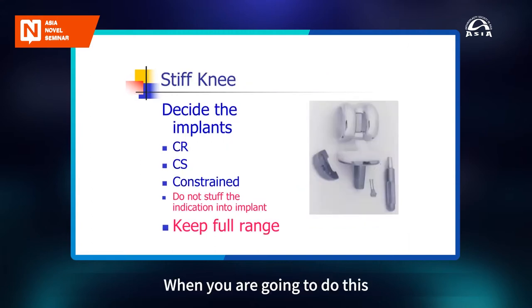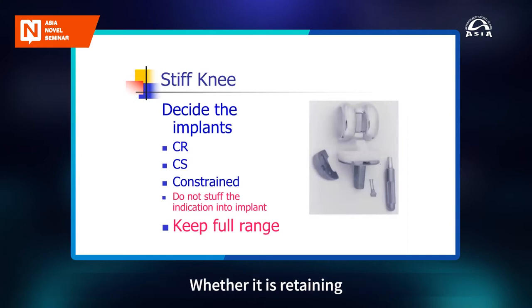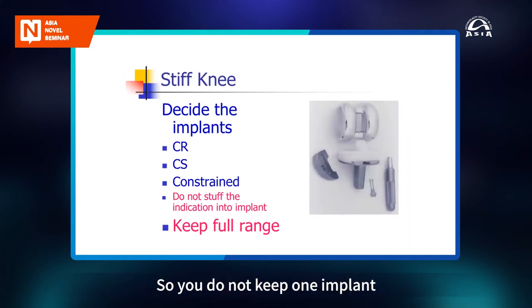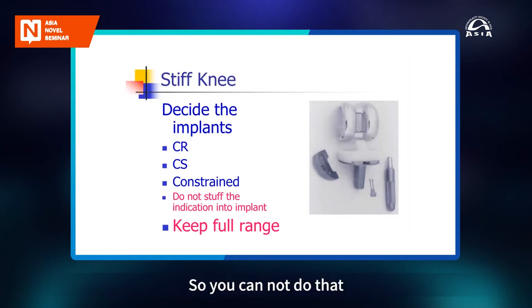When you go in to do this, you must have the full range of knee replacement equipment, whether it is a cruciate retaining or sacrificing type of knee, or a constrained knee. Do not stuff the indication into the implant; the implant should be used as per the problem. So you do not keep one implant and then try to fit your problem into that implant. I always do cruciate retaining, but when I go in, there is no cruciate ligament. It's all gone. So you can't do that. You must have everything handy.